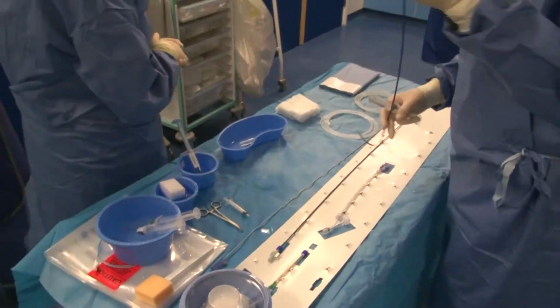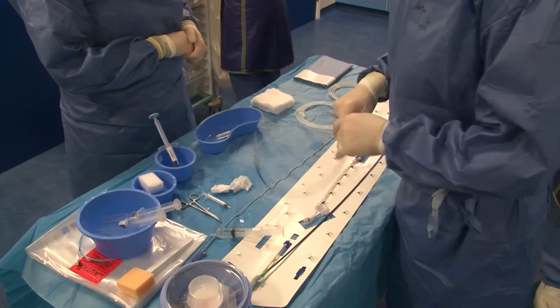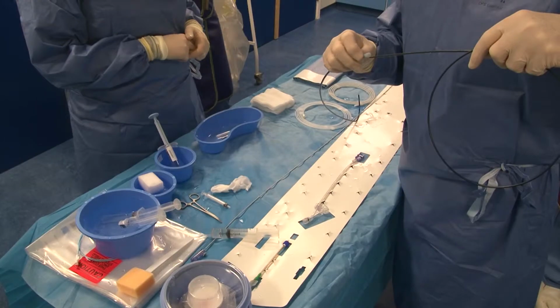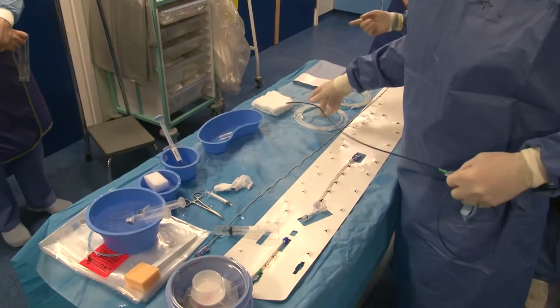Right. So this is an 8 French delivery sheath, which we can just flush. So we just flush both parts and pass it to Richard to make the catheter exchange. It has a 45-degree bend on the tip.